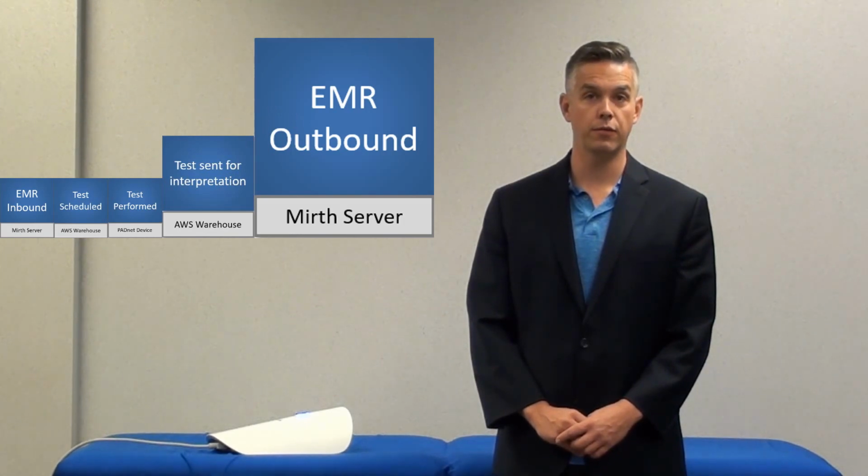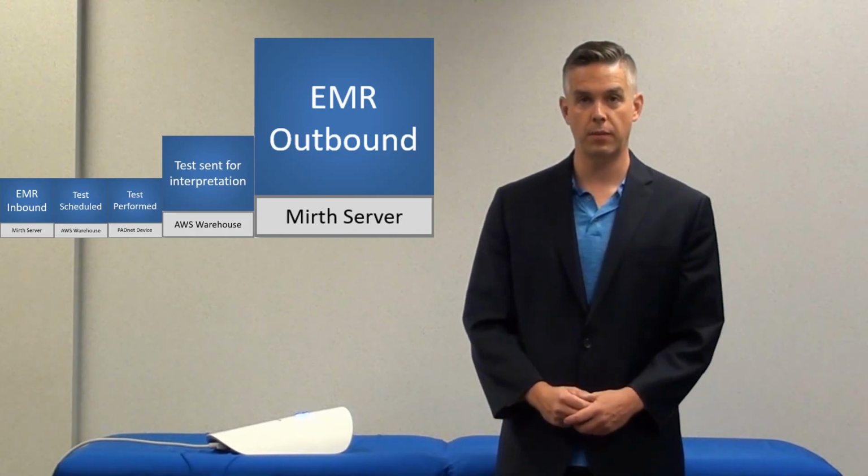And there are a number of different formats that we support for importing that data into your EMR. So that's how data flow works in the PADnet system.